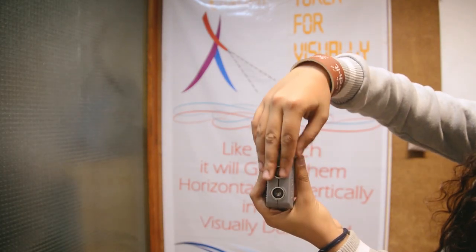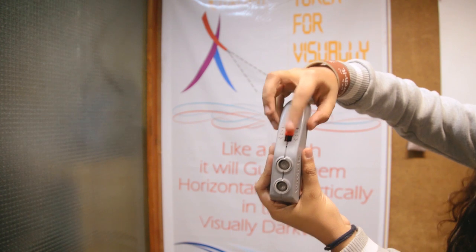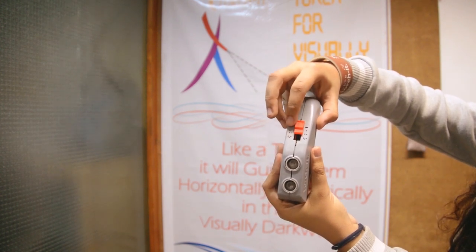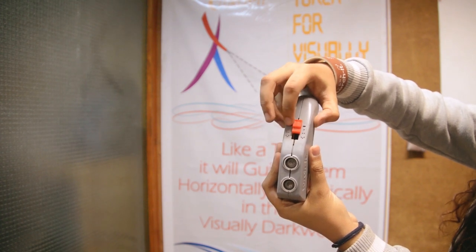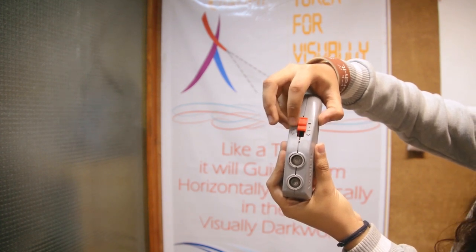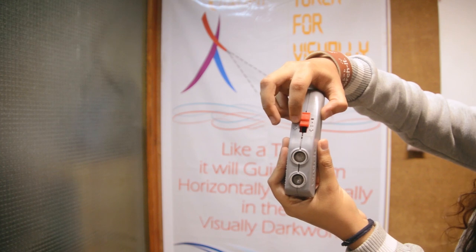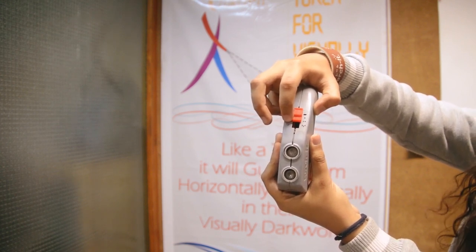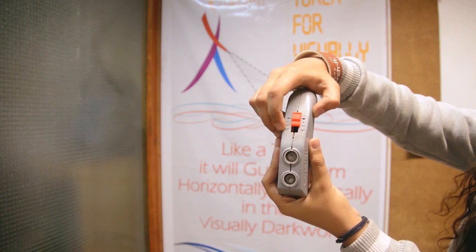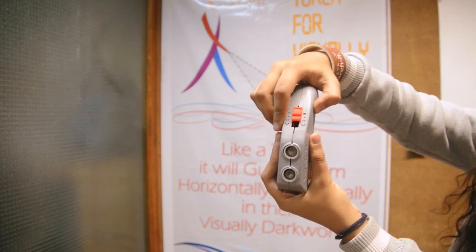As you slide your hand upwards, you will feel there is a switch. Beside the switch there is a slash, one dot, two dots, and three dots. The slash means off, one dot means object detection at three feet distance, two dots means object detection at five feet distance, and three dots means object detection at eight feet distance.